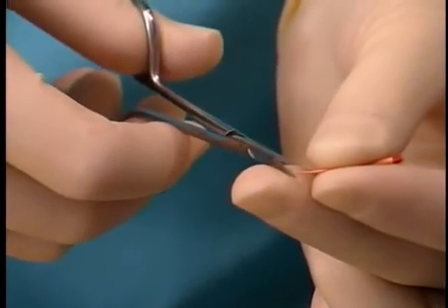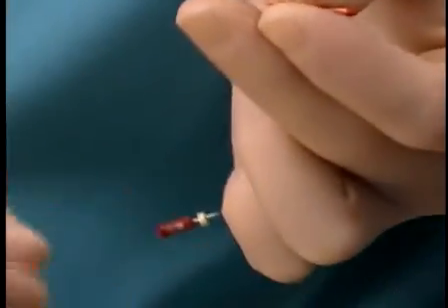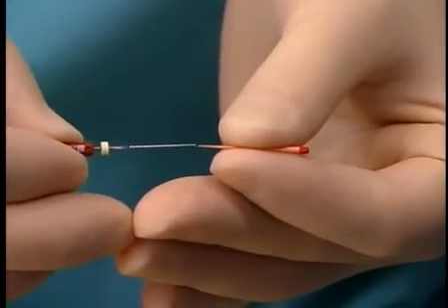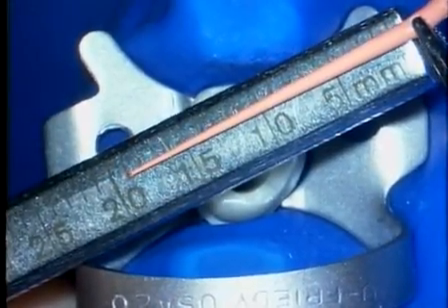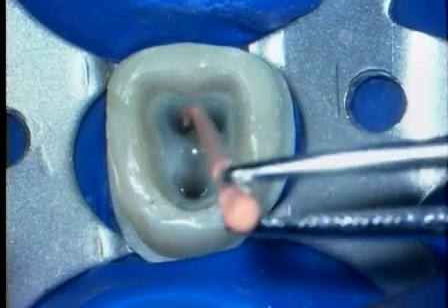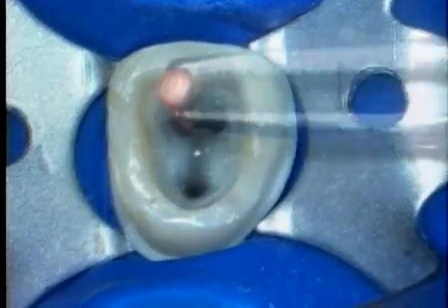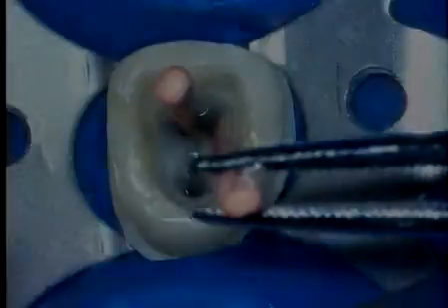Since we have utilized gauging and tuning procedures, the master cone is carefully trimmed so that its apical diameter perfectly corresponds to the last file that was snug at length. The master cone is measured and notched coronally to correspond to the length of the canal. The pre-curved master cone is placed in a wet canal. When placing master cones into root canal systems, they should be gently moved to length.